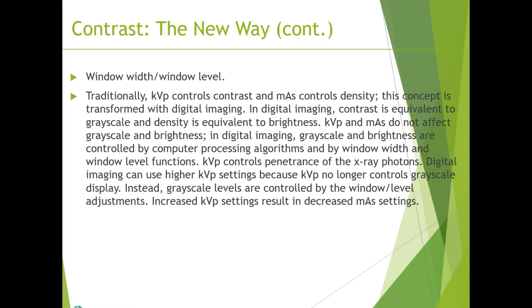So the kVp is controlling the penetration or the photons needed, but digital imaging is using a higher kV setting because kVp no longer controls that grayscale, thus resulting in a lower dose to the patient.